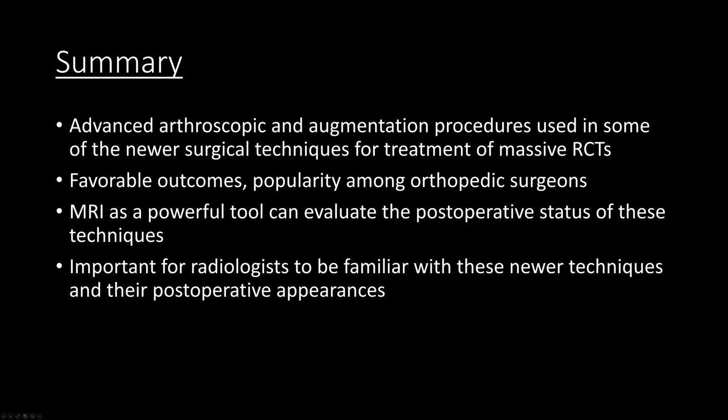So that brings me to the end of my talk. In summary, the advanced arthroscopic and augmentation procedures used in some of the newer surgical techniques for treatment of massive rotator cuff tears are providing favorable outcomes and gaining more popularity among some orthopedic surgeons. MRI, as we know, is a powerful tool with which to evaluate these surgeries and post-operative patients. So I think it is very important for us to be familiar with their post-operative normal appearance and to know the complications and potential pitfalls. Again, I want to thank you for inviting me, and I'm glad to take any questions.